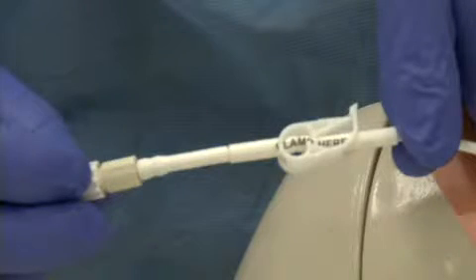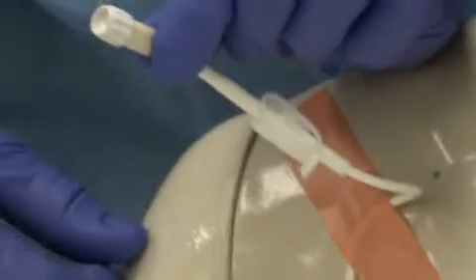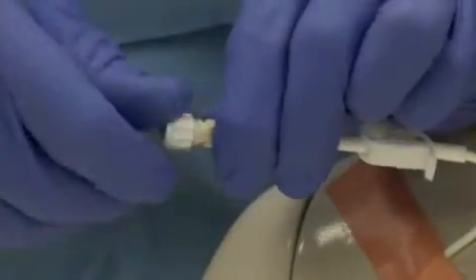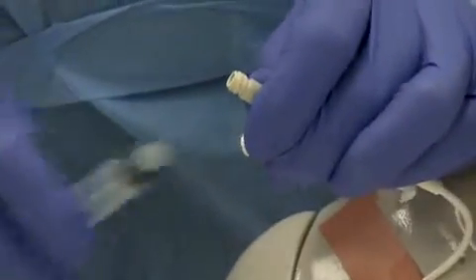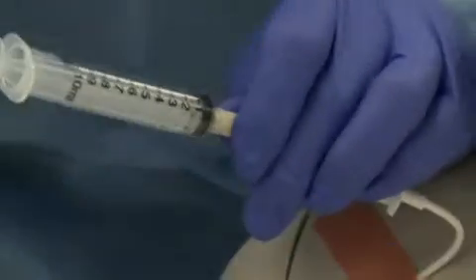To initiate access, close the clamp and remove the protective cap. Attach the empty, sterile 10 cc syringe to the access port and engage the Luer lock. Release the clamp and withdraw 3 to 5 cc's of fluid from the line.